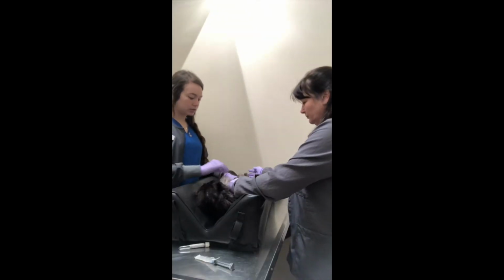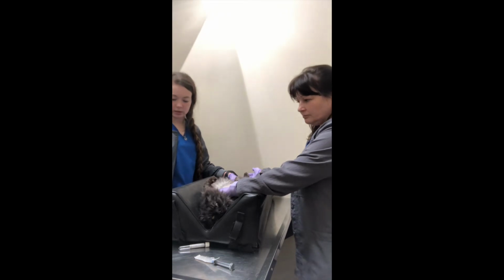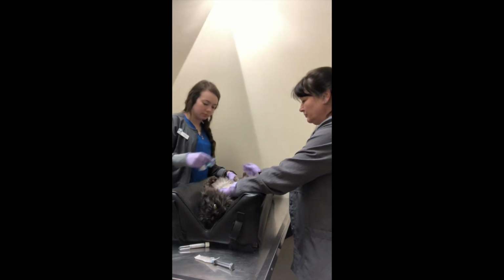We're going to do a cystocentesis on Tybalt. We're going to use the ultrasound to assist. So I've got her clipped already, and I'm going to do a surgical scrub with a Chlorhex and alcohol solution, alternating them.